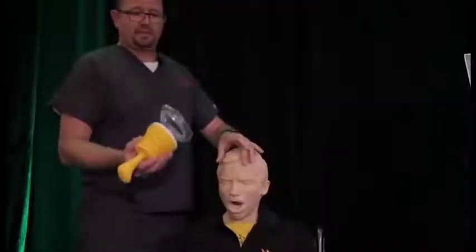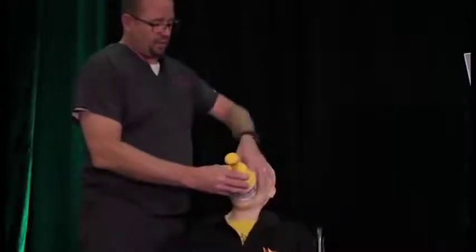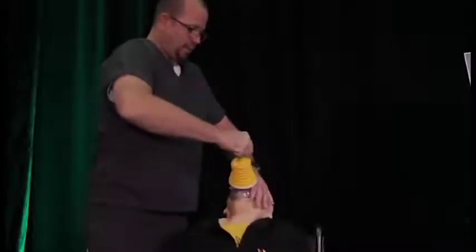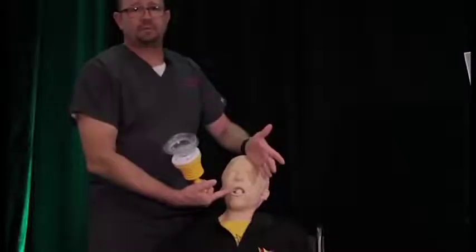Hello, my name is Rodney Millspaugh and I'm a paramedic, also a consultant with LifeVac. Our goal today is to show you steps you can take if you have the ability to help someone who is choking and is in a wheelchair. It's a very simple process. Take the face mask portion and put it over the victim, get a good seal, push down on the plunger, and abruptly pull up. As you can see, we have relieved the foreign object that was in the patient's trachea.